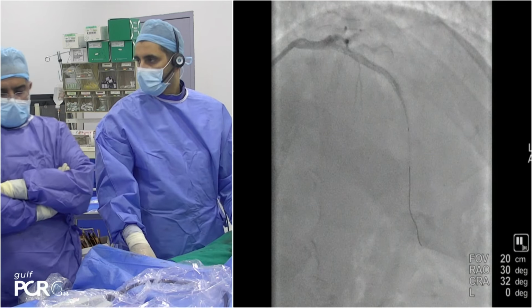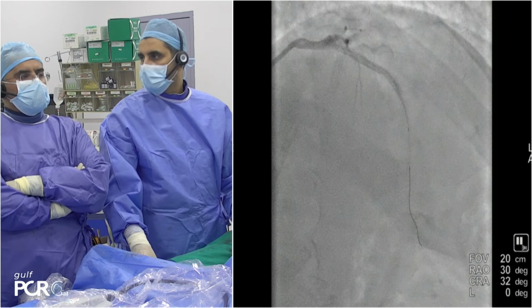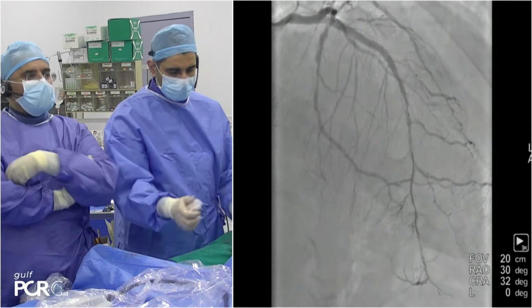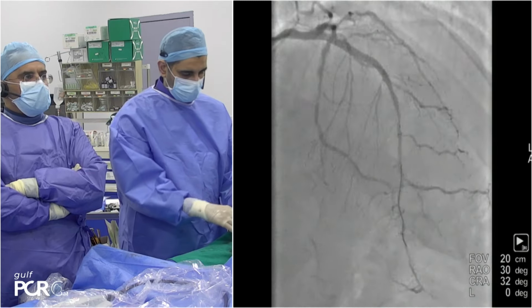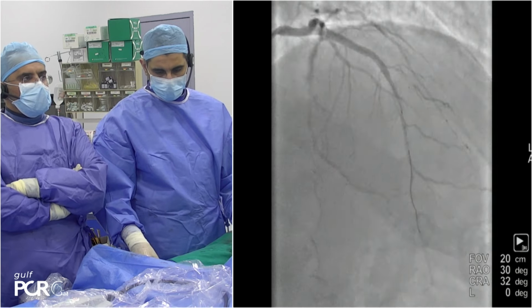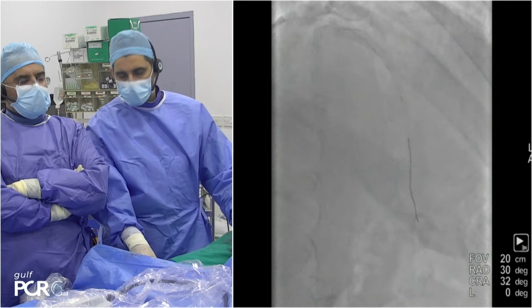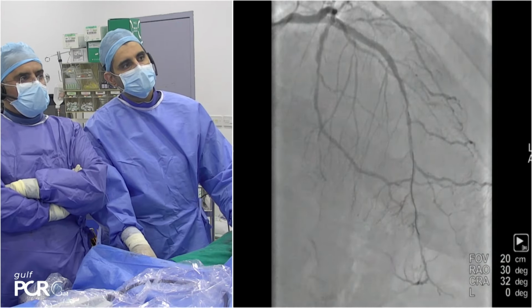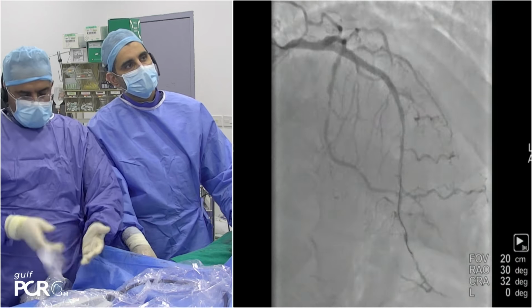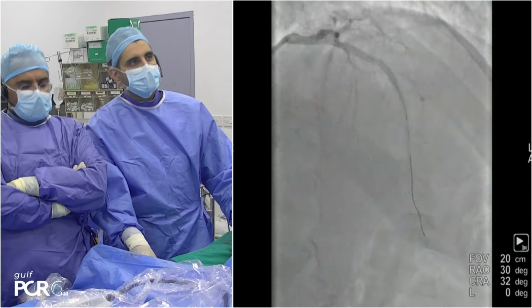That's an option. Maybe Julio, we can ask you what would you do now? I'm sharing the main preoccupation about the distal segment and the outflow. Why not use Integrilin, Aggrastat, small molecules, to clean the thrombus. The thrombus is not only there, but is in different parts. So this is what we can do. So the expansion was ameliorated. It remained below the threshold, but at least we can be sure for the next time to get the patient fully anticoagulated and in the best possible situation.